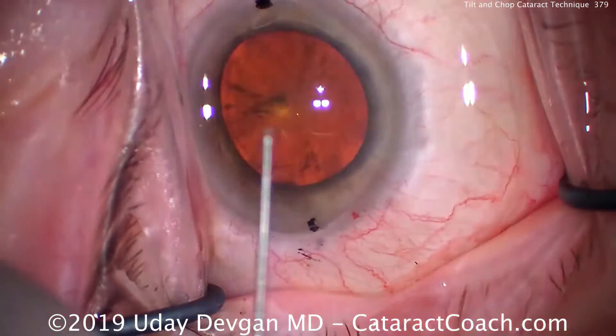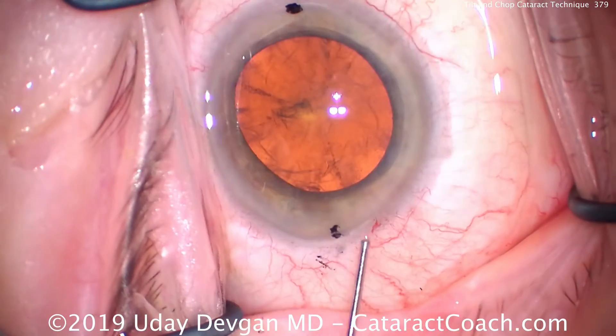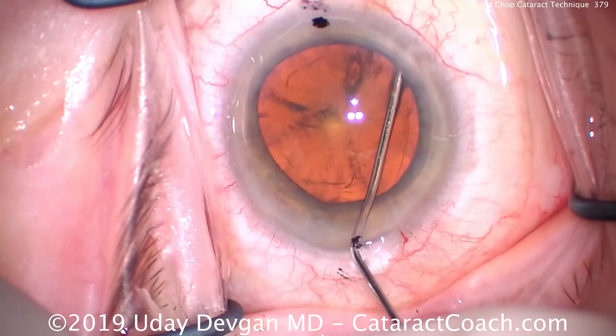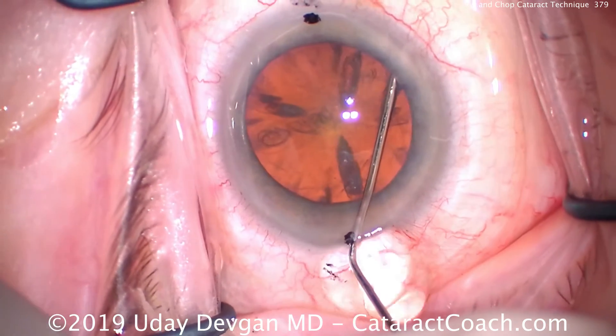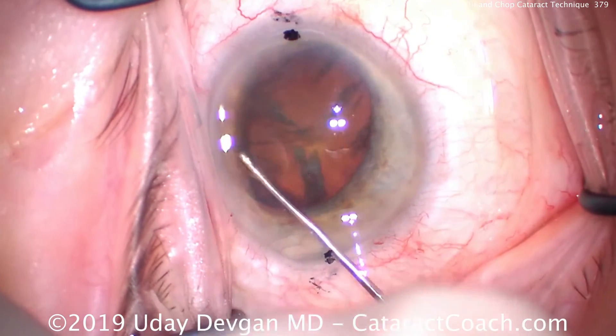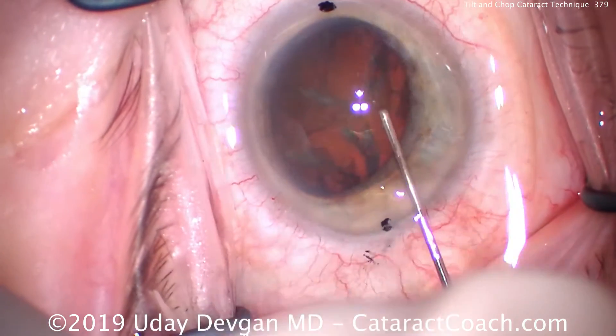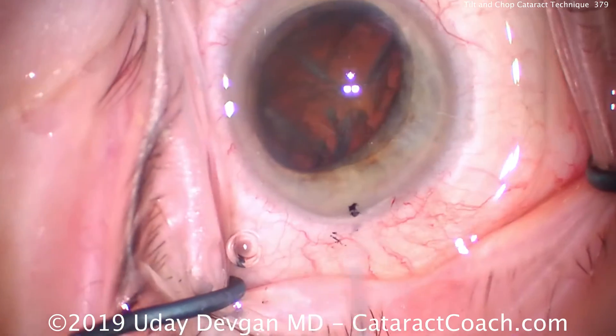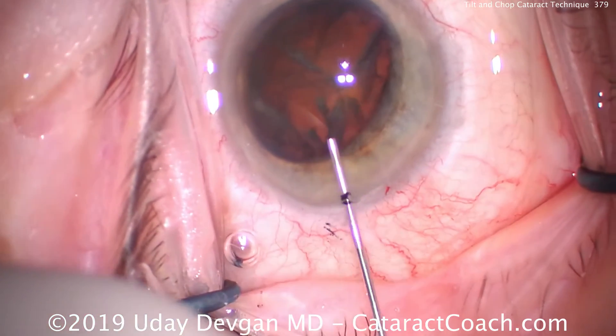Now I'll use balanced salt solution on a blunt cannula and we'll do some gentle hydrodissection. We don't need a whole lot of force here — it's a mild amount of force, but slow and consistent. And just like that, we get the nucleus partially prolapsed. Using the cannula now, we'll lift the nucleus up just to make sure that we have a small portion of it above the iris.